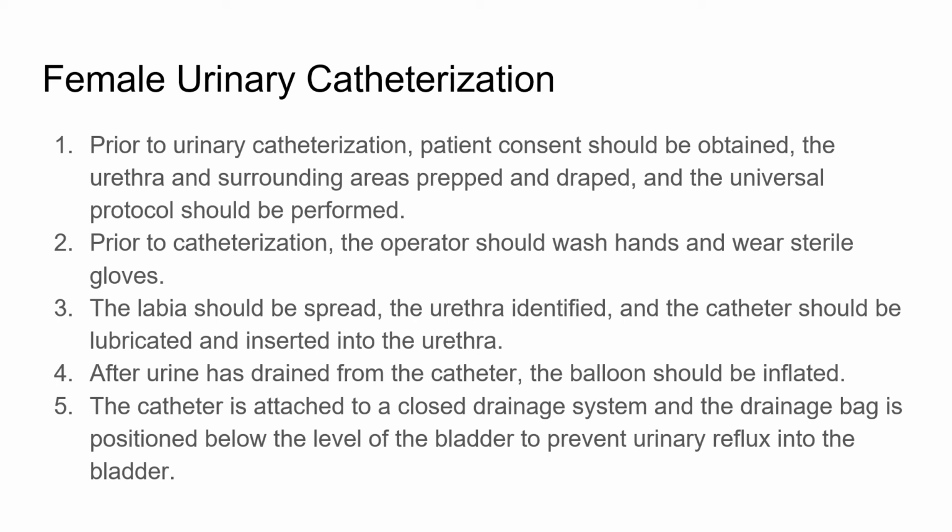After urine has drained from the catheter, the balloon should be inflated. The catheter is attached to a closed drainage system and drainage bag, and it is positioned at a level below the bladder. It should not be kept above the bladder, but below the bladder, to prevent urinary reflux back into the bladder.